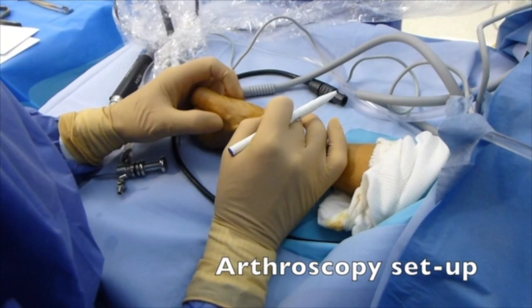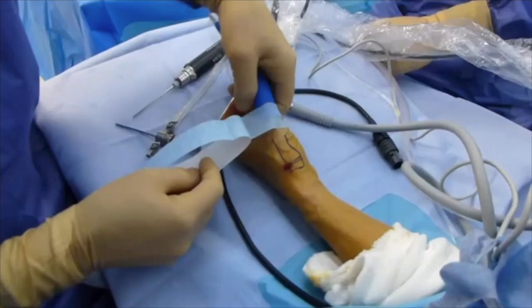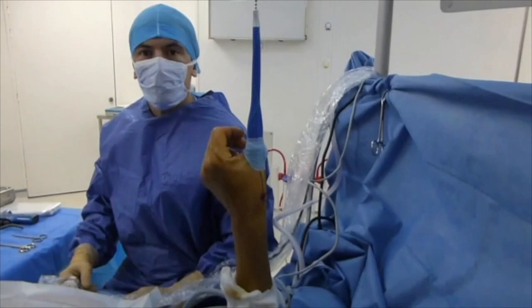Arthroscopy of the trapeziometacarpal joint is relatively difficult because of the narrow intra-articular space and the difficulty of maintaining traction. Good installation is necessary.